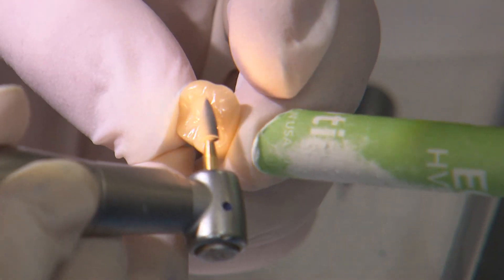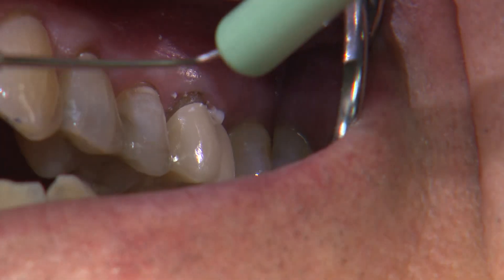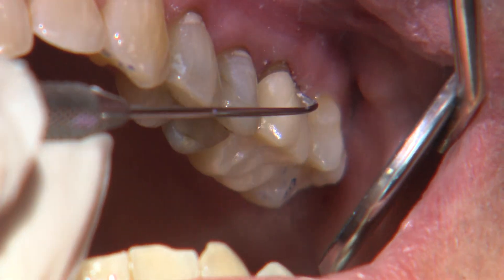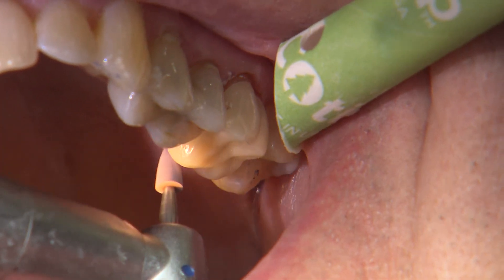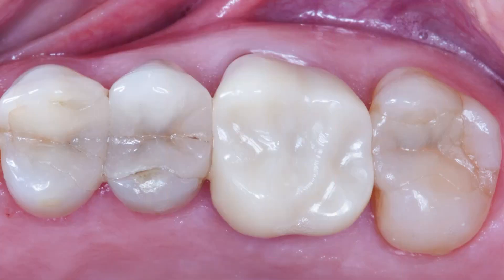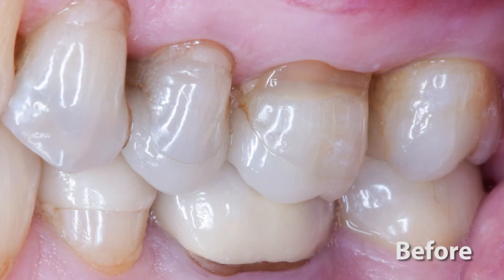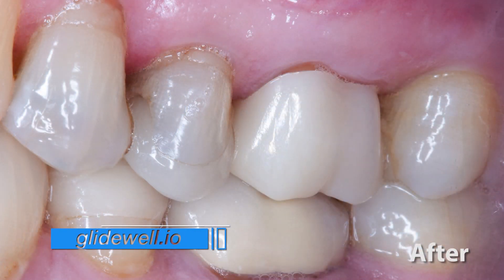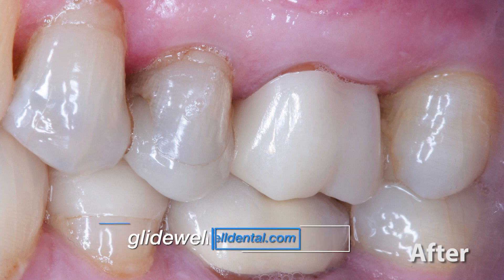After a quick polish, the Bruxer Now crown is cemented into place. With no oven firing cycle needed, it goes straight from the mill to delivery without any compromise in strength. If you'd like to learn more about how this amazing technology can enhance your practice and provide control over your restorations, please visit glidewell.io or glidewelldental.com. Thank you so much for your time. Back to you, Will and Megan.